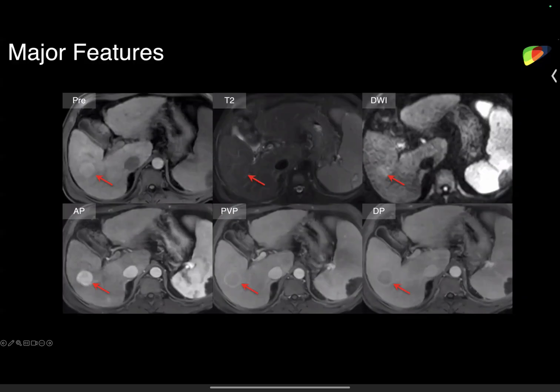Let me present a couple of examples of how these reports are used. So this vignette shows a cirrhotic liver with a 22 millimeter mass located in segment 6, which is intrinsically hyperintense in T1. On the bottom row, we can see that there's APHE along with washout appearance, most conspicuous in delayed phase, and capsule appearance. This mass is virtually identical or isointense to the background liver in T2, and it presents mild signal hyperintensity on diffusion-weighted imaging.